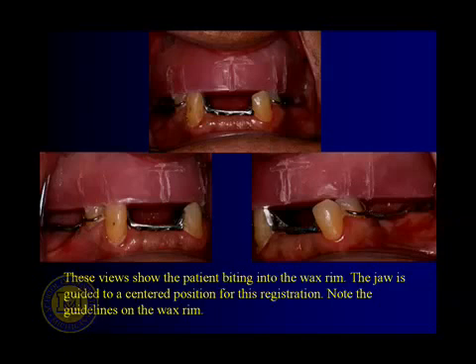What am I looking for? I'm looking for the fact that A, they can get their lips together. So let's say for the sake of argument, I ask them to do that and they're sort of stretching their lips like a guppy or something, like a fish. Okay, what do you suppose that would be indicative of?